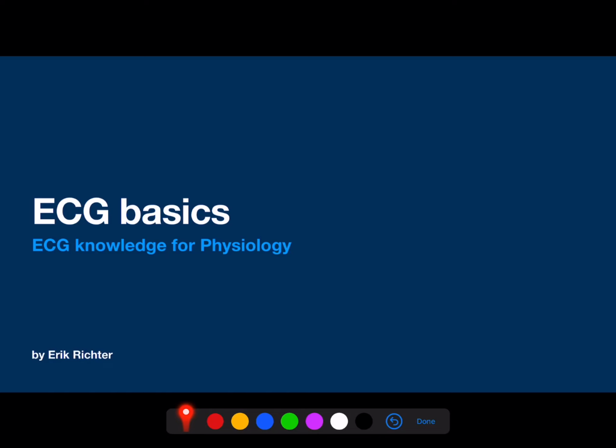Hello, today I would like to talk about the ECG basics and the knowledge that is required for the physiology exam, and I hope that in the end you will have a good understanding about how to analyze an ECG and how to recognize some basic arrhythmias.